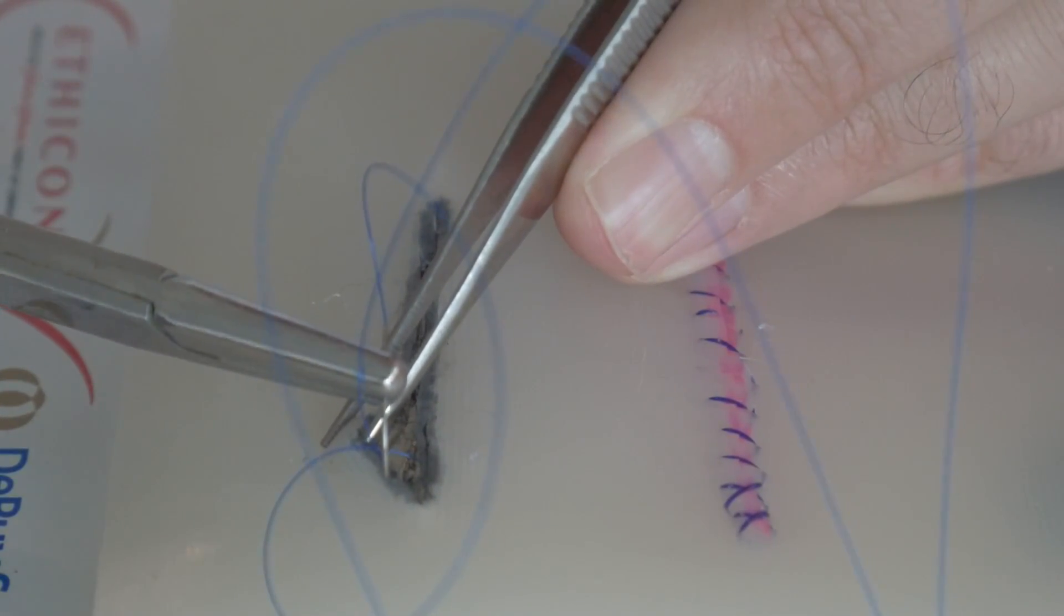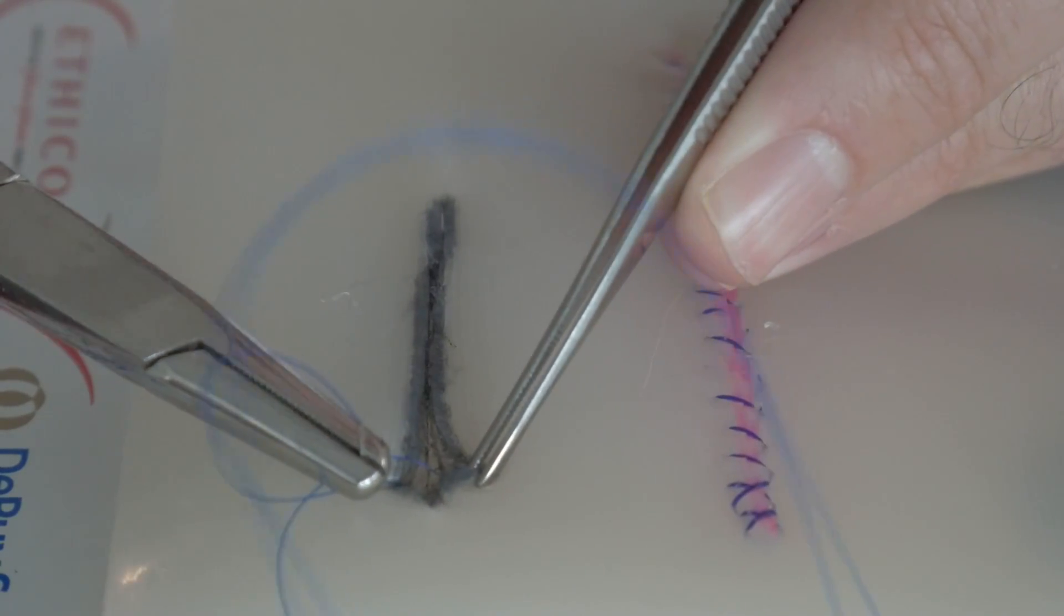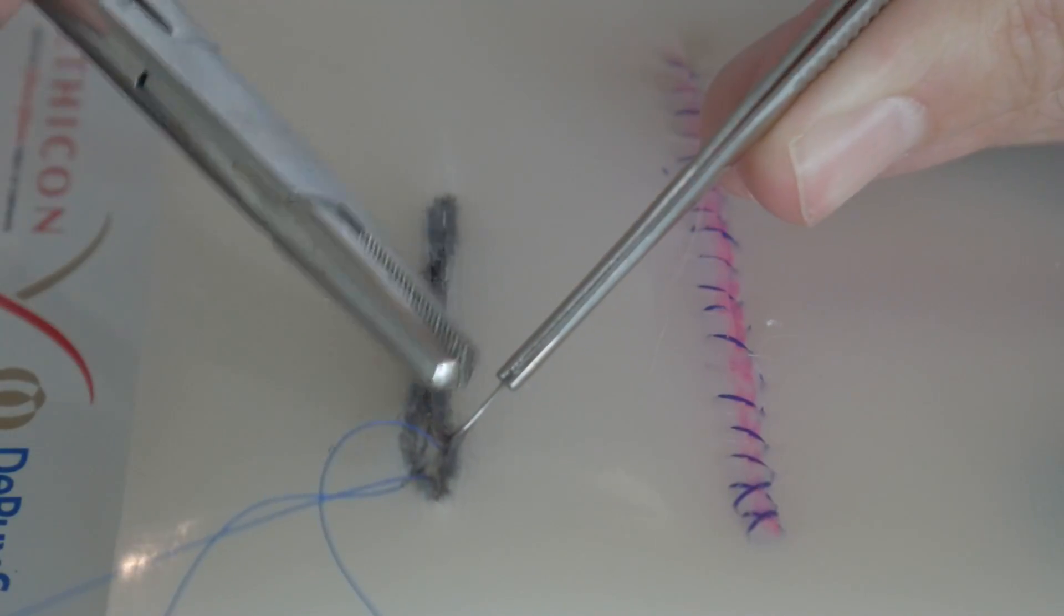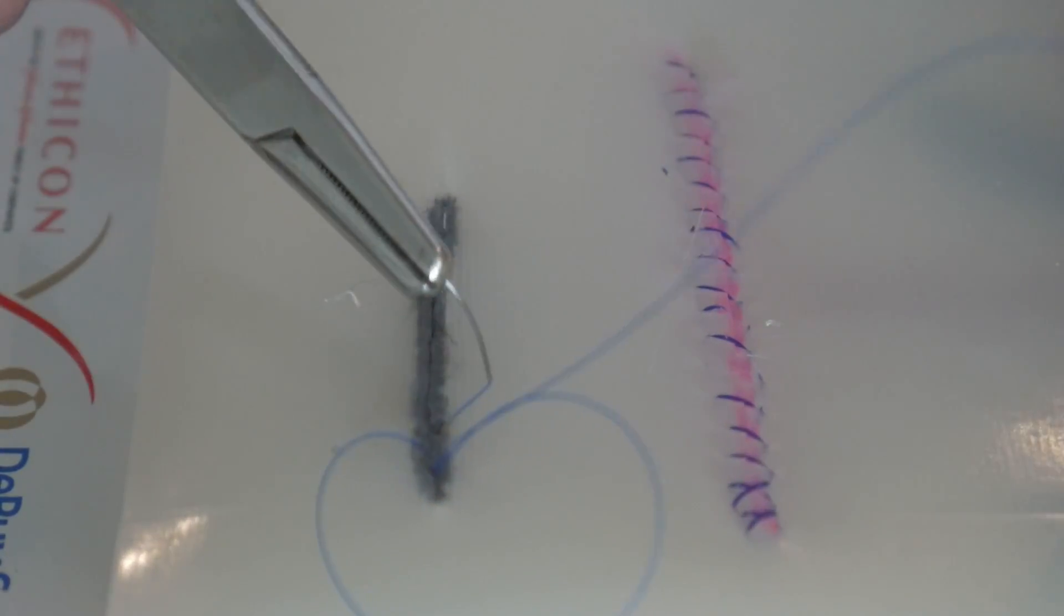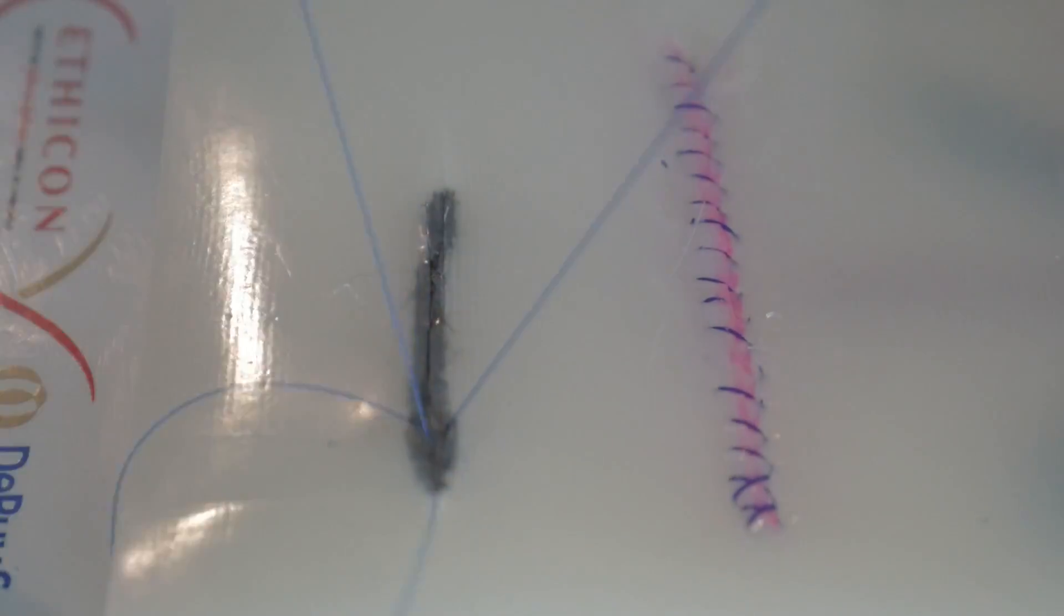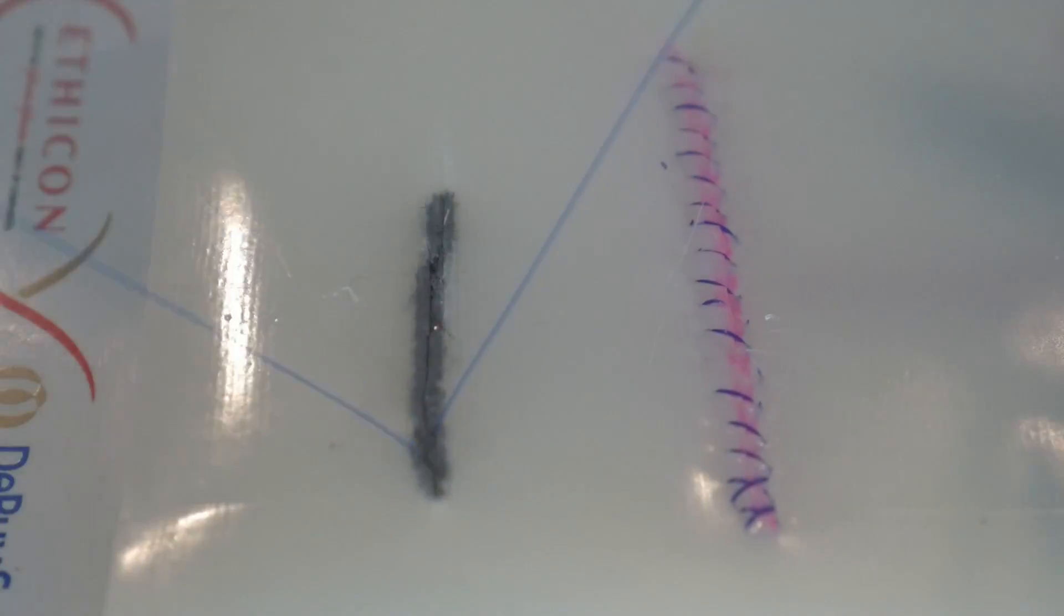So then when I tie this down, it's going to be burying the knot on the bottom side of the suture instead of on the top. And yes, I know I'm using a Prolene suture. That's why it's blue. But normally we wouldn't use this on a running subcuticular stitch. Normally we would use a Vicryl or a Monocryl for closing skin. Only reason I'm using Prolene on this is because it's highly visible and it shows up really well on the camera because of the bright blue.